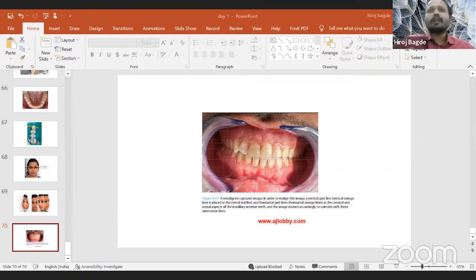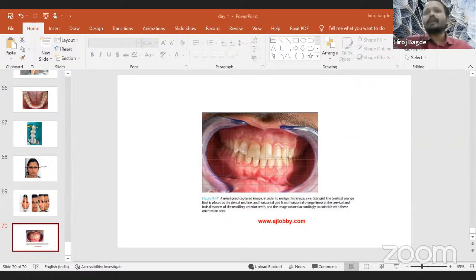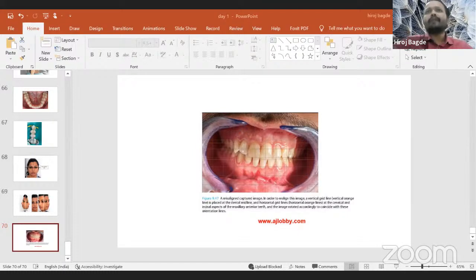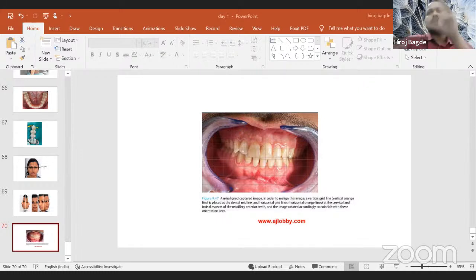From this criteria, I will just see what is inside the oral cavity. I don't want the eyes, nose, or cheek retractors. The cheek retractor here is used incorrectly — it has to be two separate cheek retractors so that the lip does not fall. My aim was to have a good image without these things. It's a bad thing that the doctor has produced something called a lip drop. You should understand why this is not to be used like this — the lip should be inside the cheek retractor.